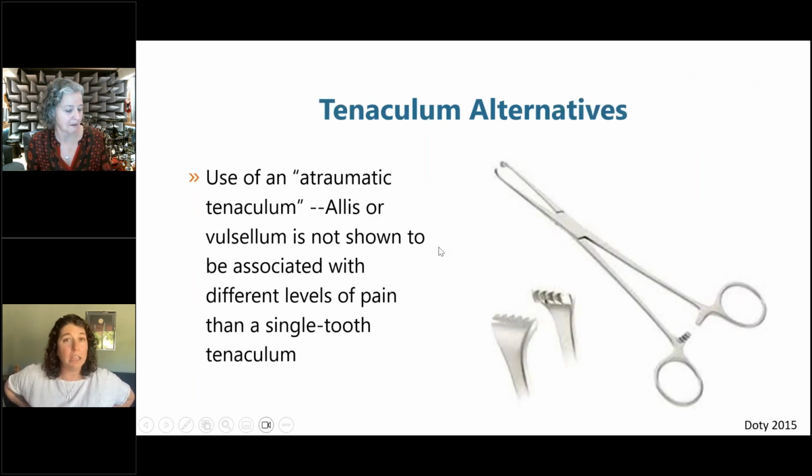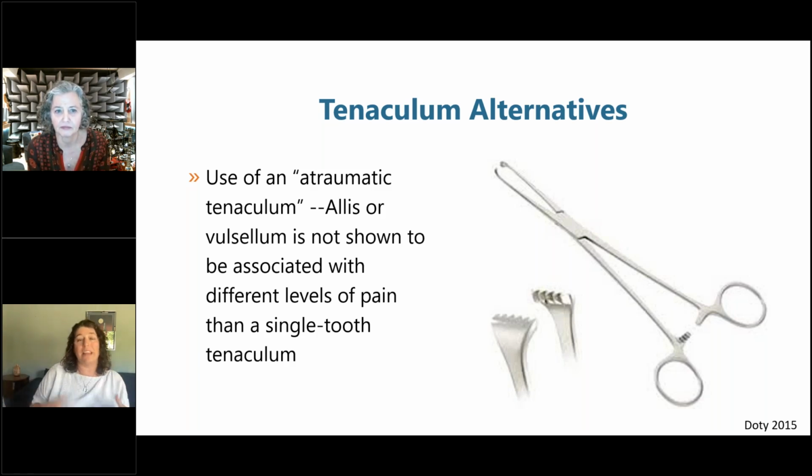I also just will say I love the handle screw. I think it's an absolutely underutilized part of the speculum, but I typically don't open it until after I've already cleansed, sometimes until I really need that space. So again, thinking about how you're using the tool to have it be in its most expanded position for as little time as possible.